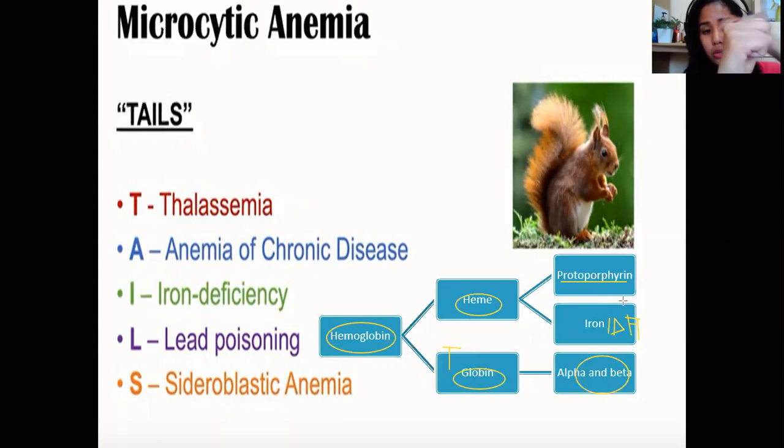So the iron surrounds, constellates or satellites around the nucleus. So there are dots around the nucleus in sideroblastic anemia. Once you find a ringed sideroblast, with iron around the nucleus, it's sideroblastic anemia. There's something wrong with protoporphyrin 9.